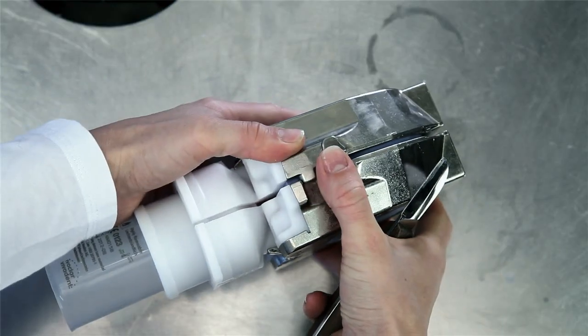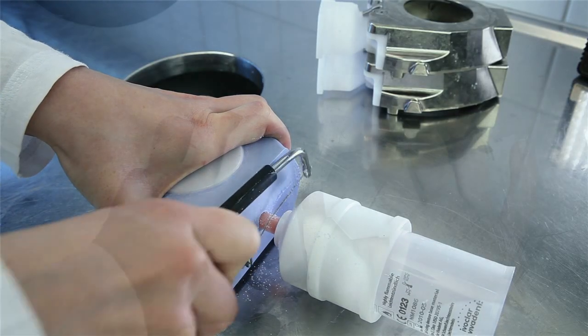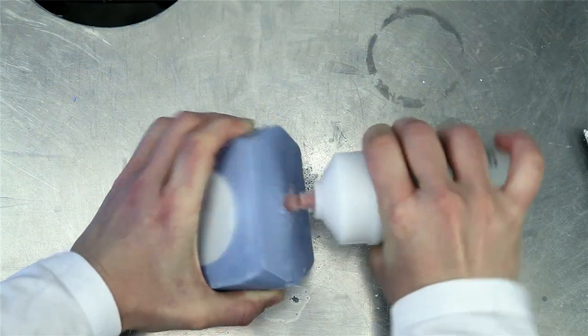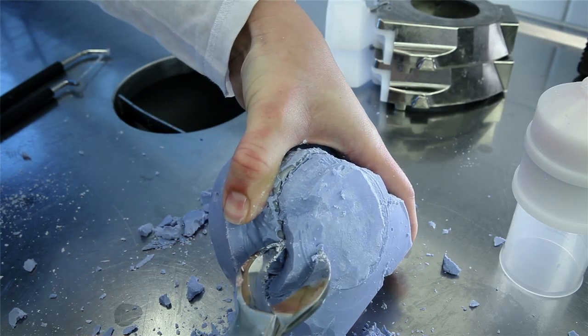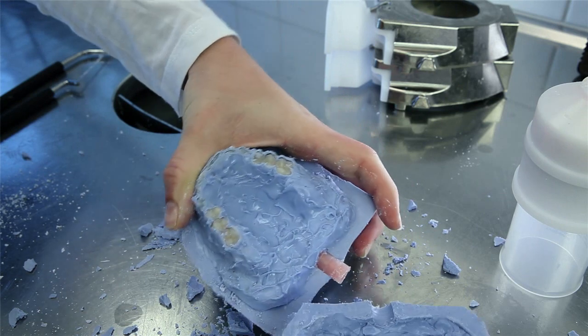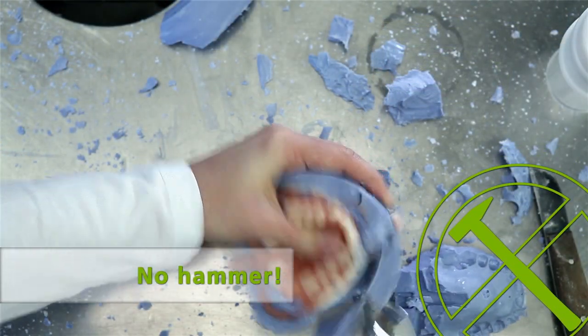Remove the stone core with the capsule and separate the capsule at the sprue using a separating disc, burr, or saw. Divest the denture from the stone core as usual with stone tongs. Do not use a hammer for divestment, since this may damage the dentures.